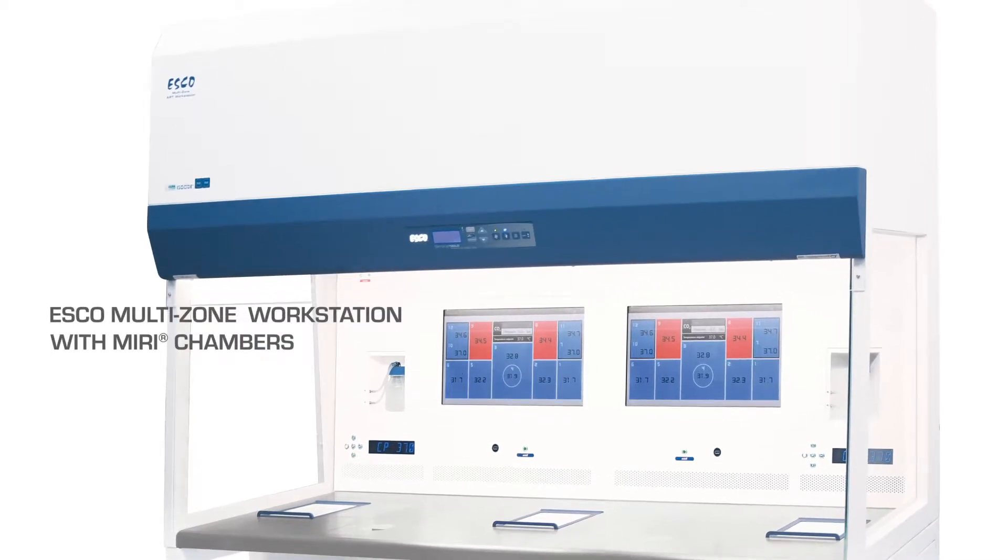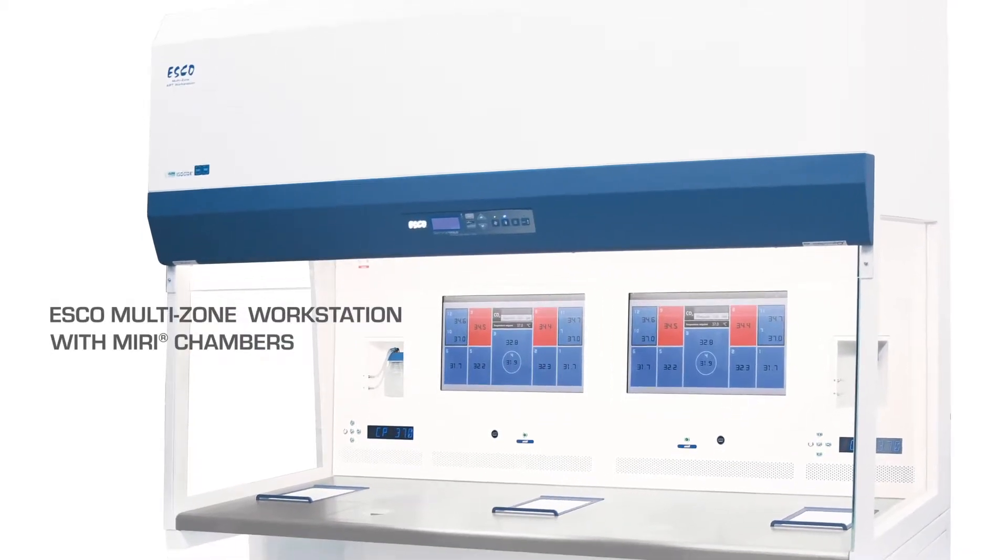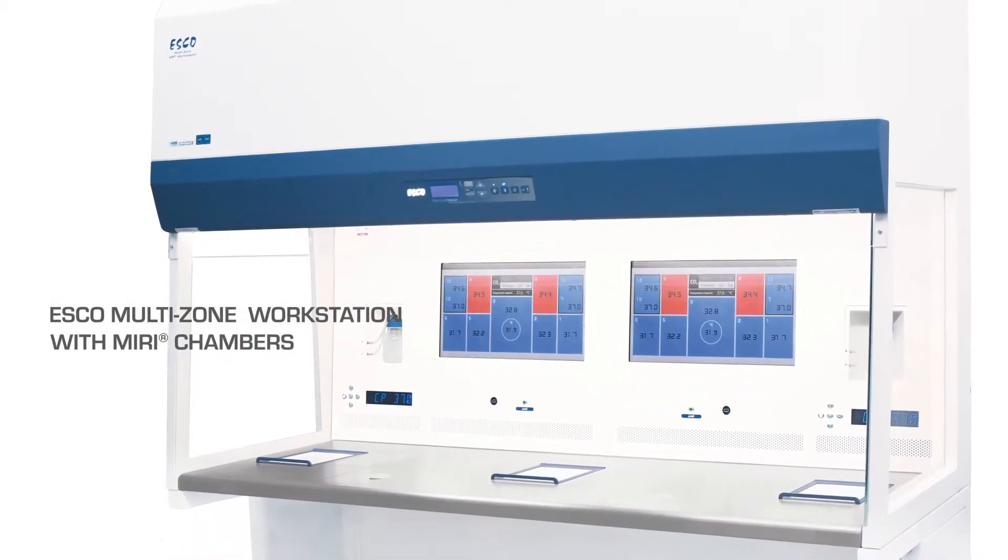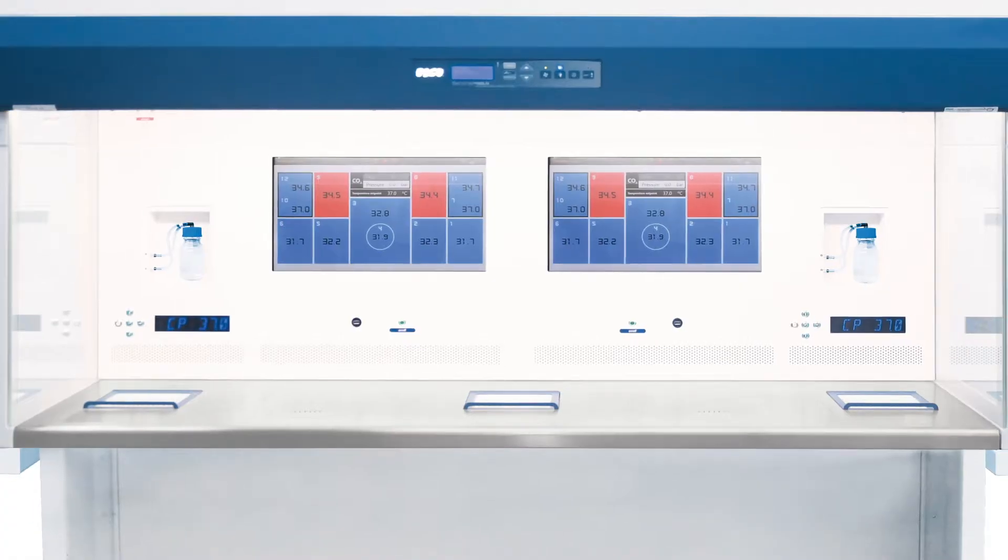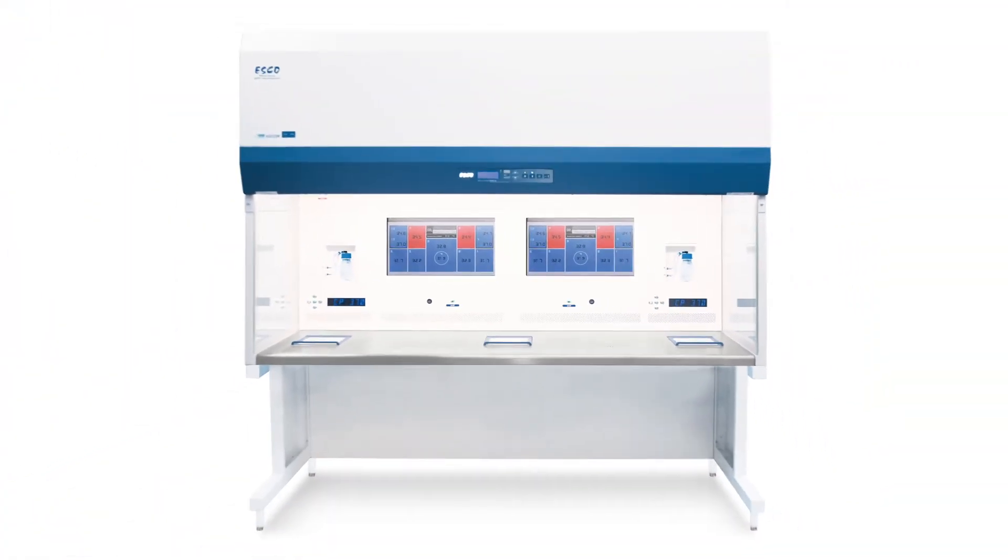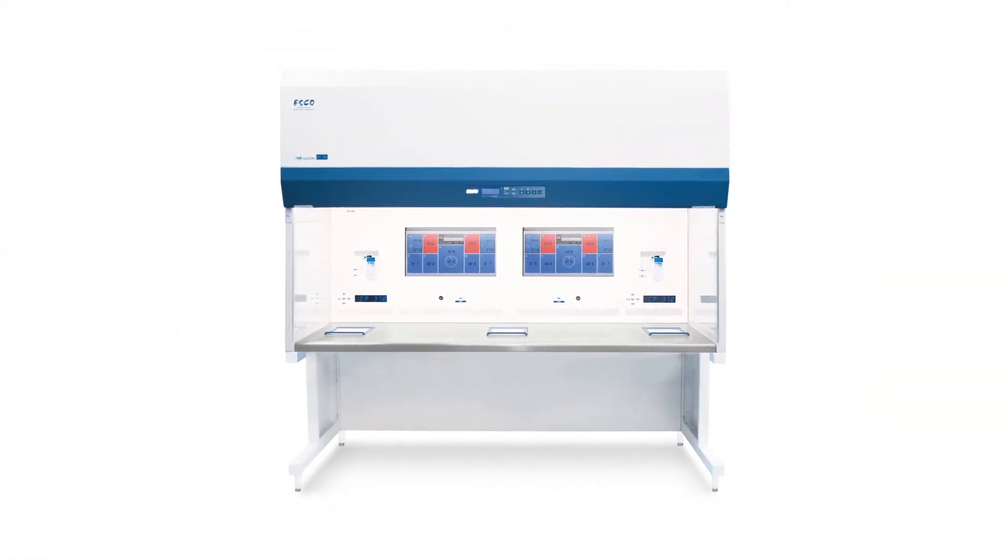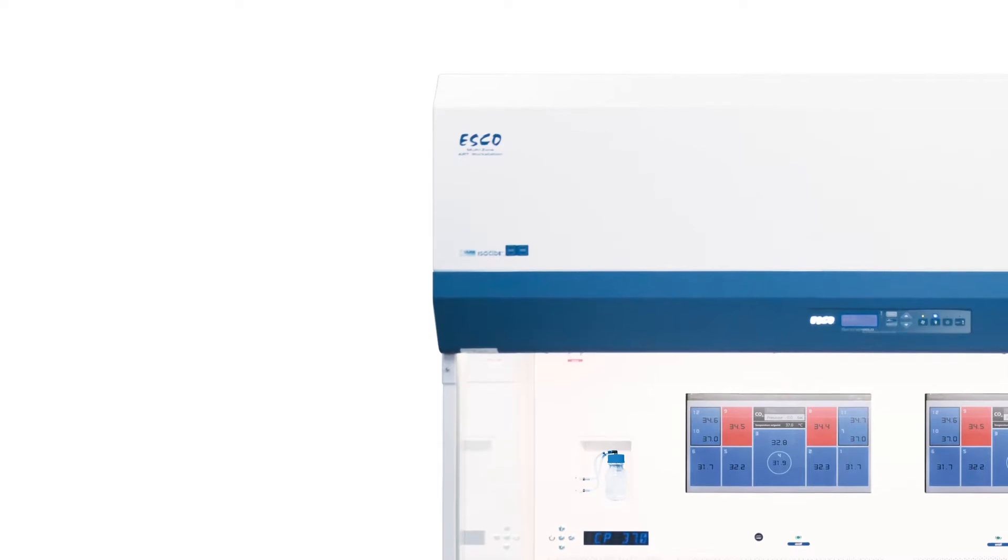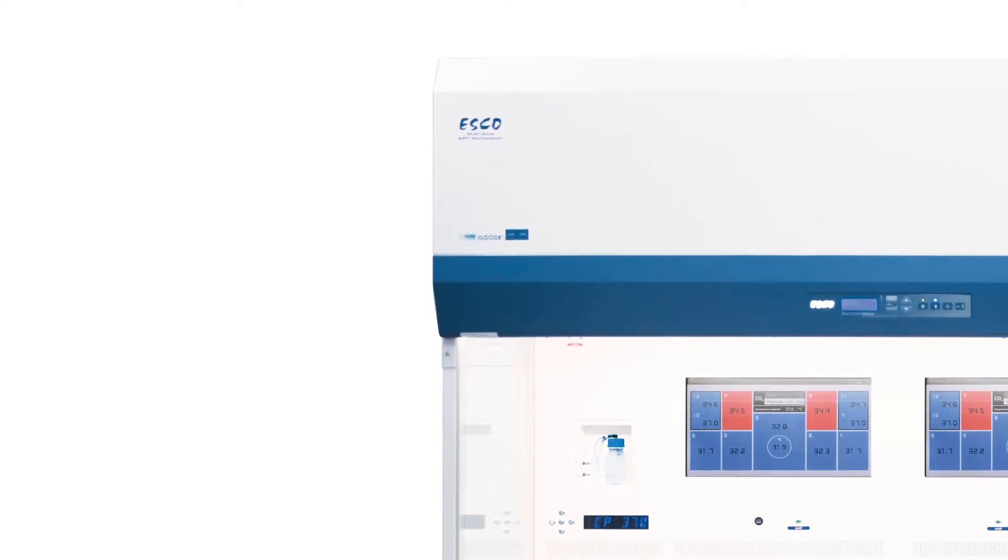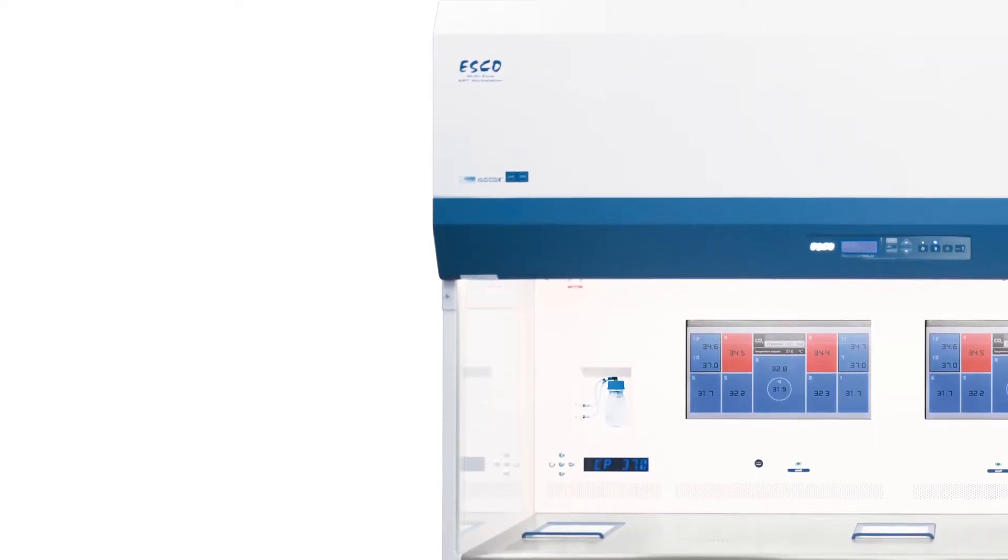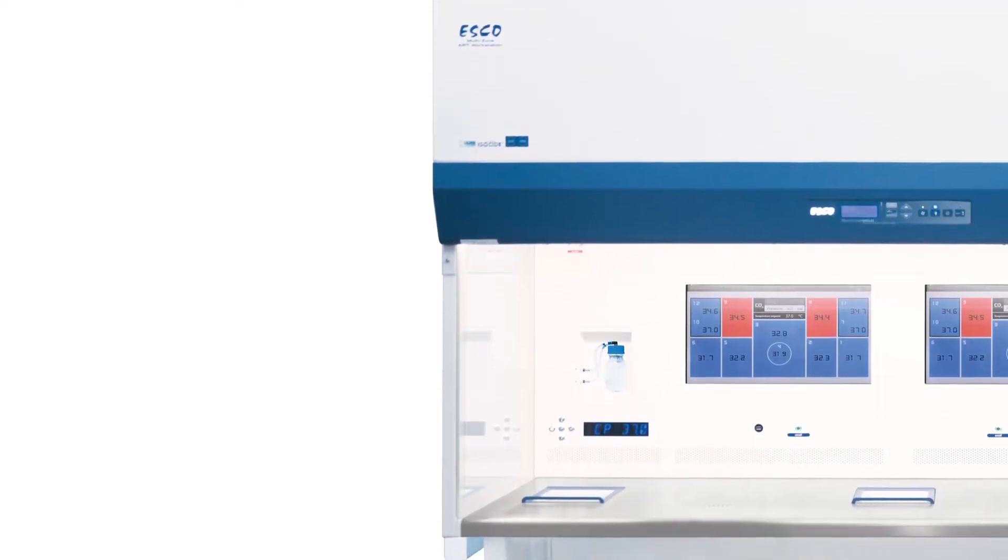Choose the right companion in your IVF lab with the only workstation having built-in incubation chambers and a tri-gas mixer. Featuring the ESCO Multizone Workstation that helps you ensure optimal results, especially for gamete and embryo manipulation.